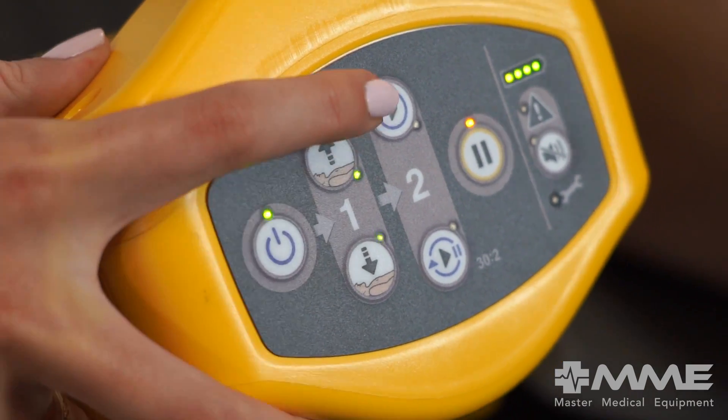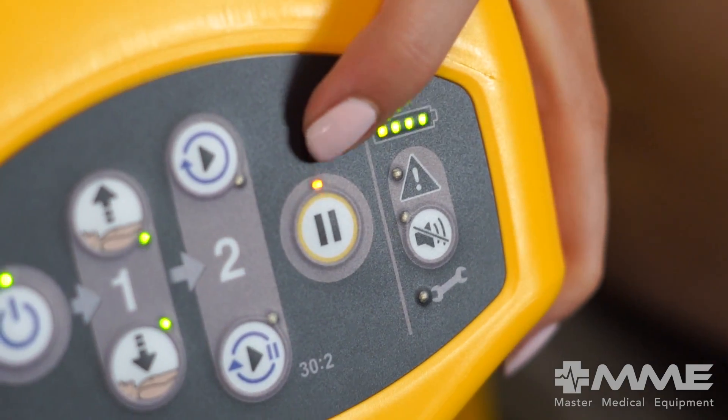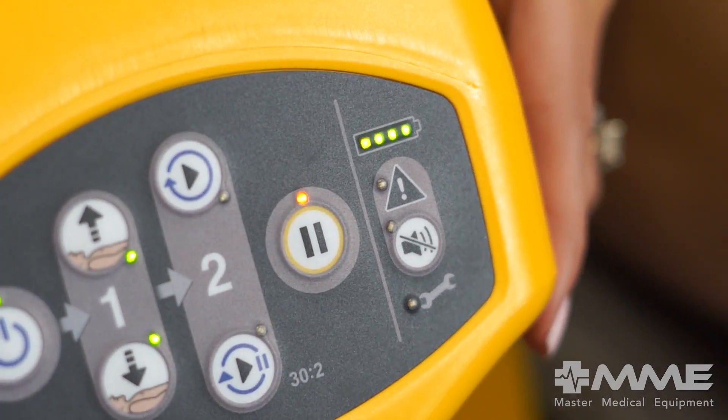Next, start compressions by selecting breath or non-breath protocol. You can adjust your protocols in the middle of a rescue. At any time, press the pause button to halt and resume compressions.